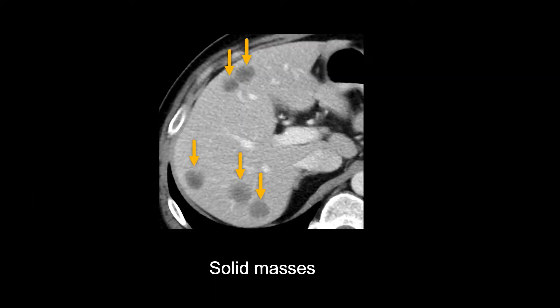Finally, there are solid masses, which often enhance less than the liver tissue, but do not appear as dark as a cyst. These masses can be benign or malignant. Multiple round masses like this are suspicious for metastases and would require further evaluation.